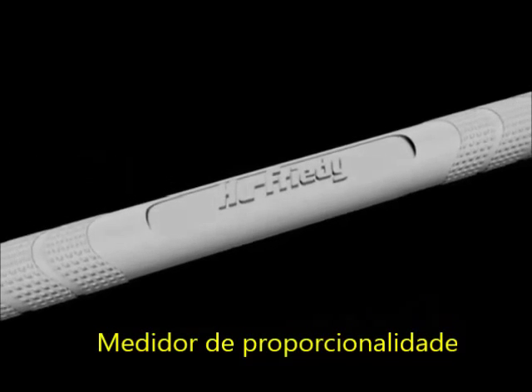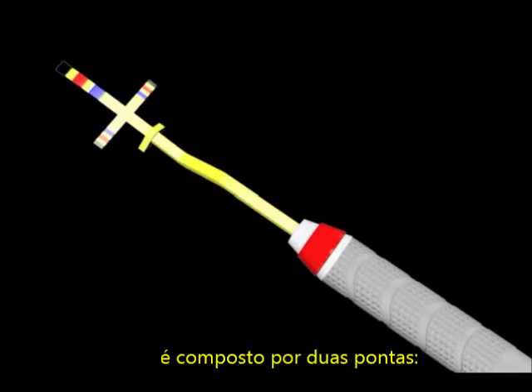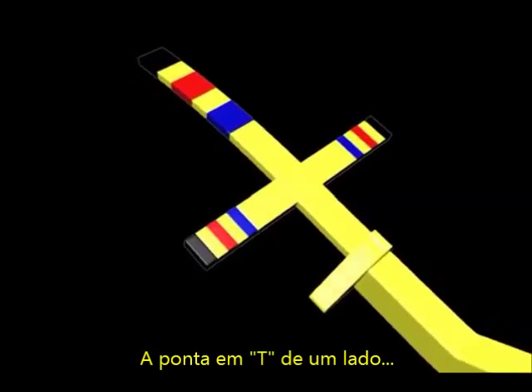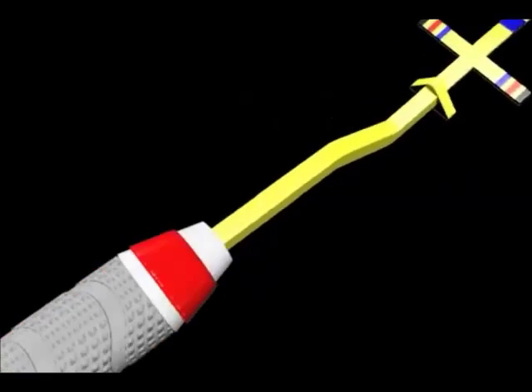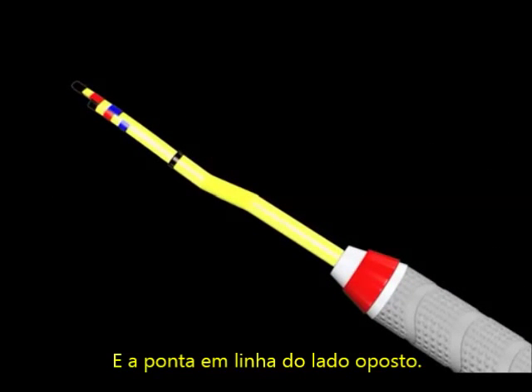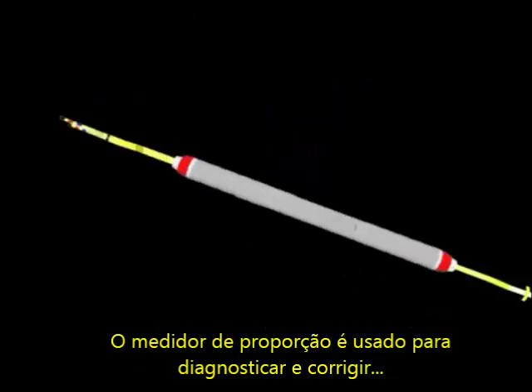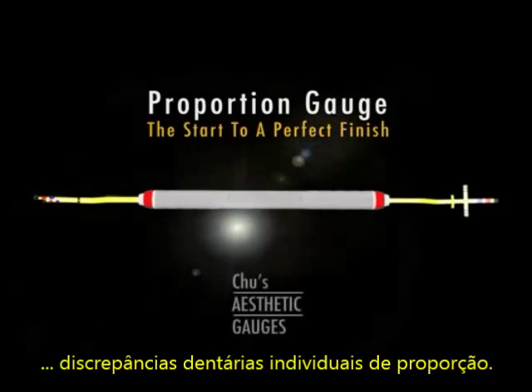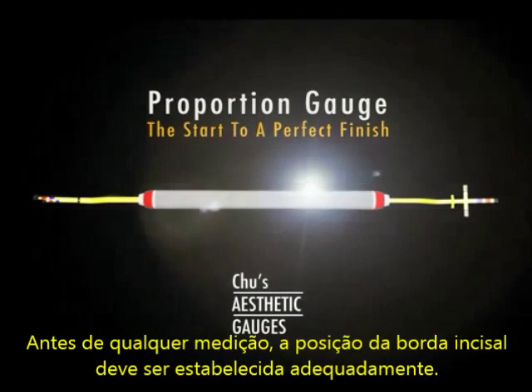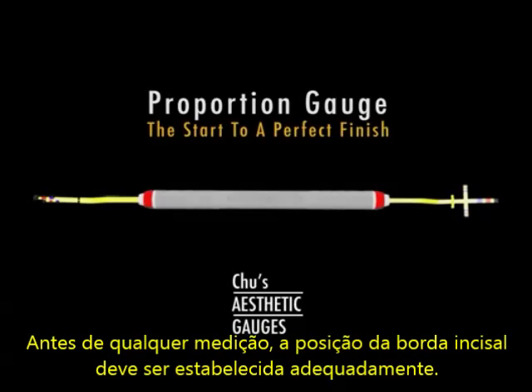Proportion gauge. The proportion gauge is made up of two tips, the T-bar tip on one end and an inline tip on the opposite end. The proportion gauge is used to diagnose and correct individual tooth size proportion discrepancies. Prior to any measurement, the incisal edge position must be established appropriately.